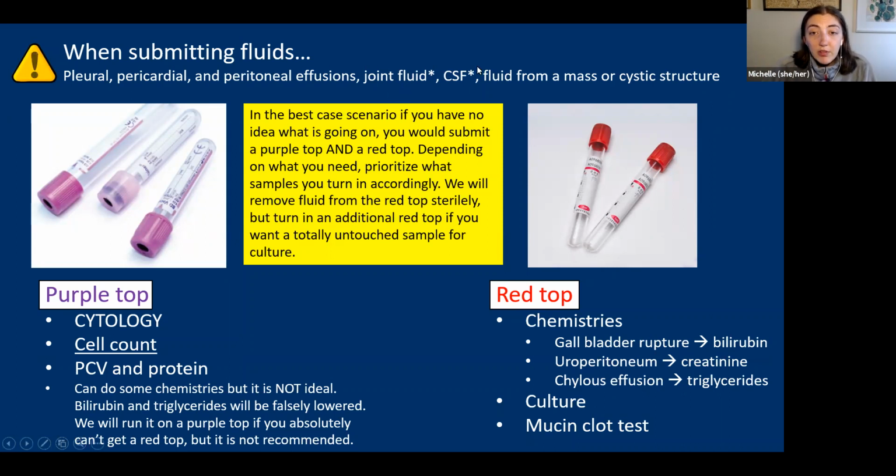And then for CSF, here we're submitting them in red tops at WSU currently. If you're out in practice, it needs to be put in a purple top. The only reason that is okay is because they're getting it processed immediately. So if you're mailing out a CSF sample, it needs to be in an EDTA.